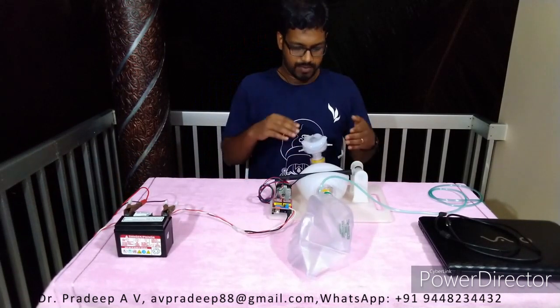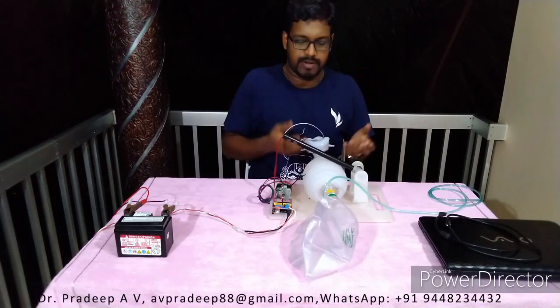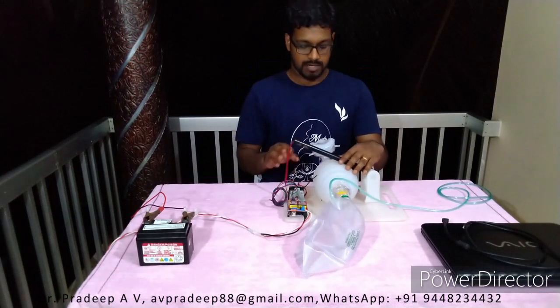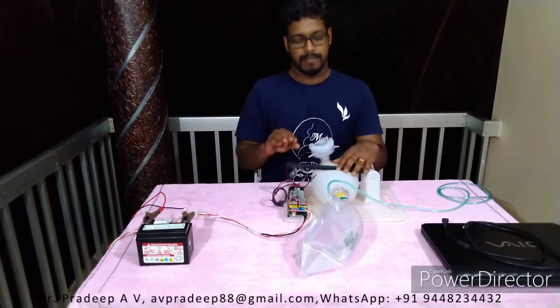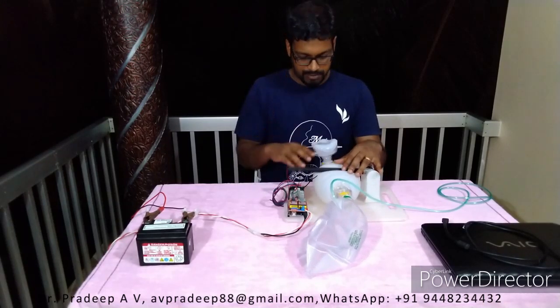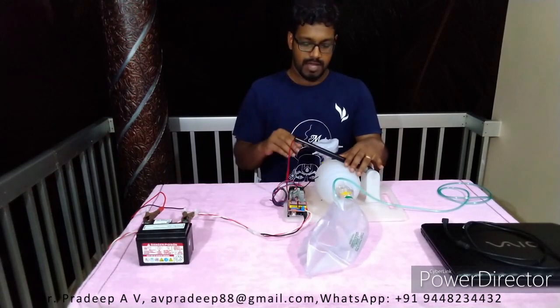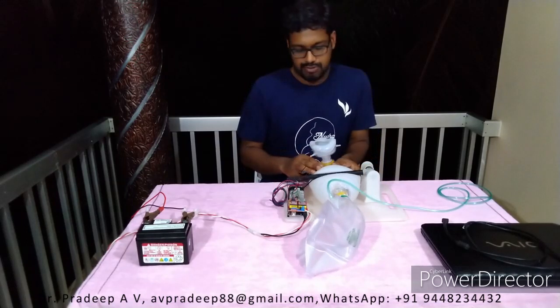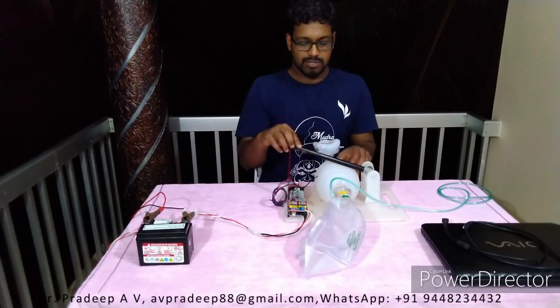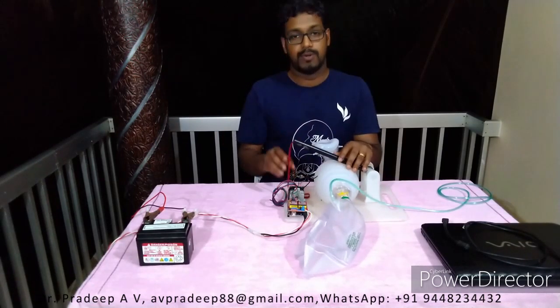So you can see, whenever I press it, air comes out, and when you relax, the air comes from here to here. Remember, this AMBU bag setup works fine at the moment, but there are a lot of things to tune: the time of inhalation and exhalation, and the pause in between. There are a couple more designs to be improved, like I need a slightly better bending. Those kinds of things have to be tuned a little bit, so I'll be doing that.